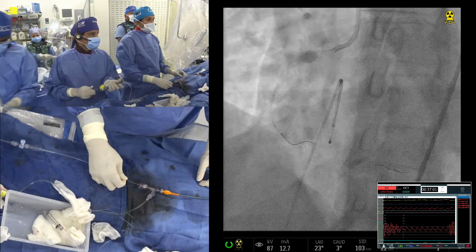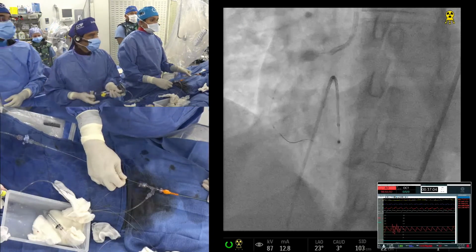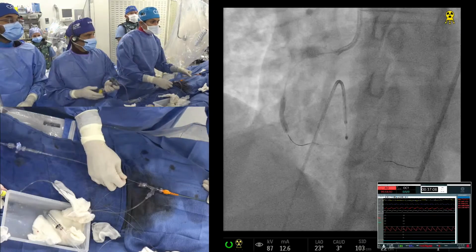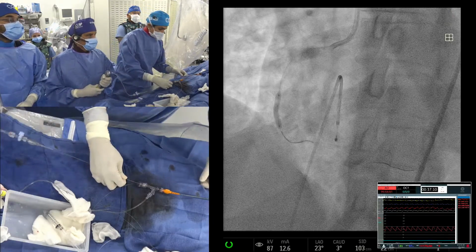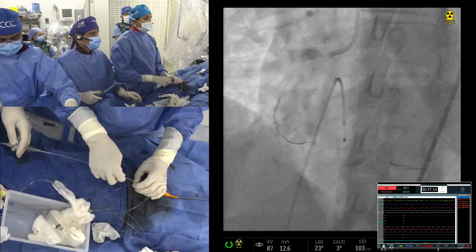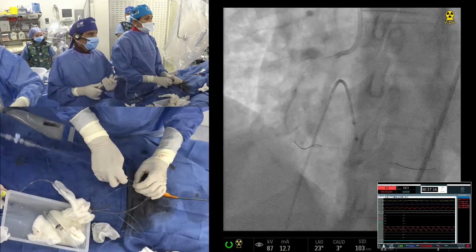This is how procedures proceed. This is the importance of a stepwise approach, safety always ahead. So, a few millimeters back. Good. With that, I'm going up.